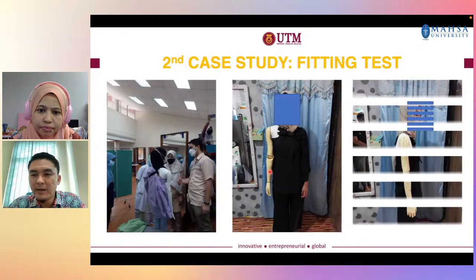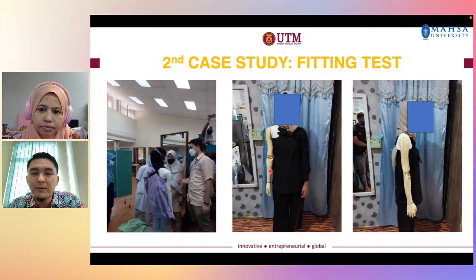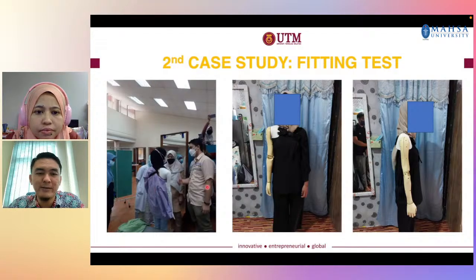And then this is the final design that we pass to the patient. So you can see the difference here, and here is really different. Okay, this is the first version, and this is the new version of the prosthetic hand. And this is also a passive prosthetic hand. It's not active. It is only useful for the aesthetic or cosmetic view. Okay, and then we do have a socket. We have the humeral part, radial part, and also the hand.